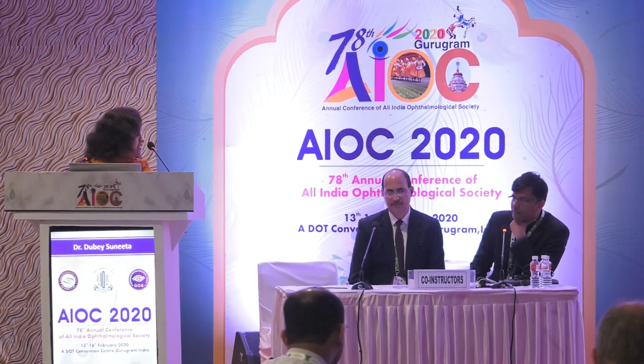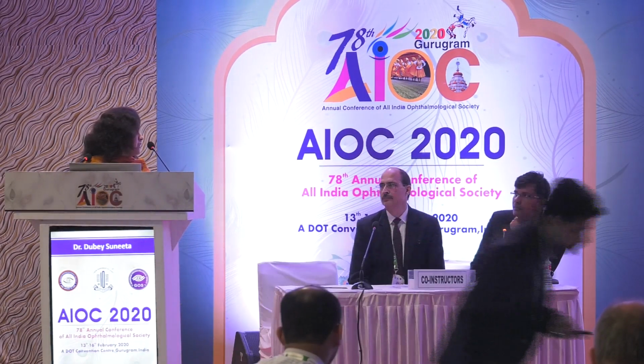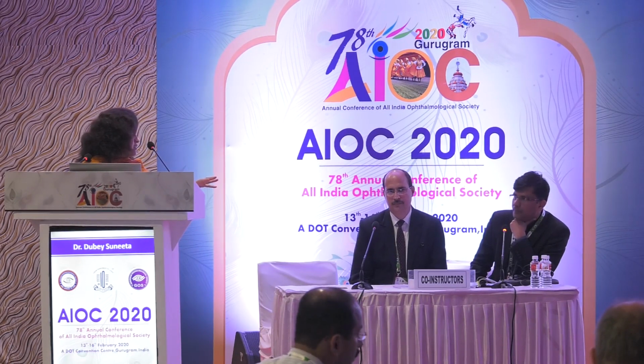Now it is said that the cornea is cosmetically more acceptable because you don't see it through the conjunctiva. So one can use cornea. Normally what I do is, as you could have seen here also, because we have that corneoscleral rim, I take a part of cornea anteriorly and a sclera posteriorly. So anteriorly it is cornea which is not seen through the conjunctiva, and then the sclera is also there.